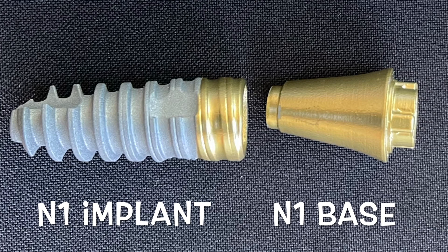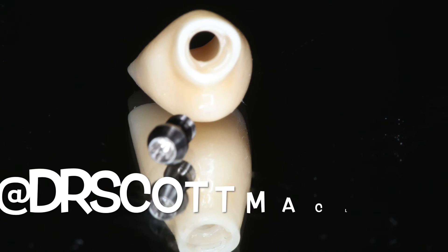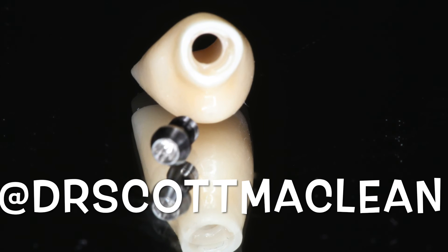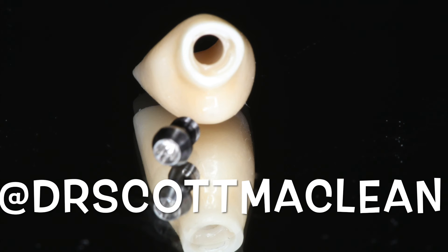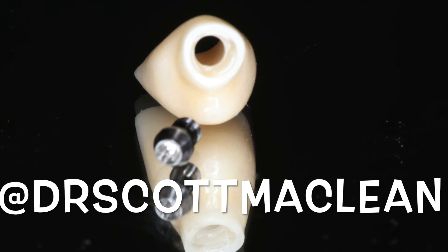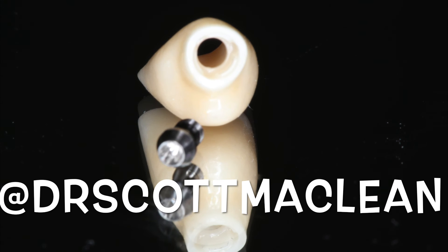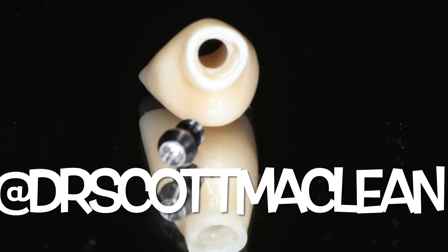Hello, this is Dr. Scott McLean, and this is a video about the N1 implant and the N1 base, which is the restorative base that you place at the time of surgery. You then come back to do an N1 angulated screw channel crown — shown here with the screw. This is a fantastic system. We're going to show you a case and how I use this with the new anatomic healing abutment and how this all works together.